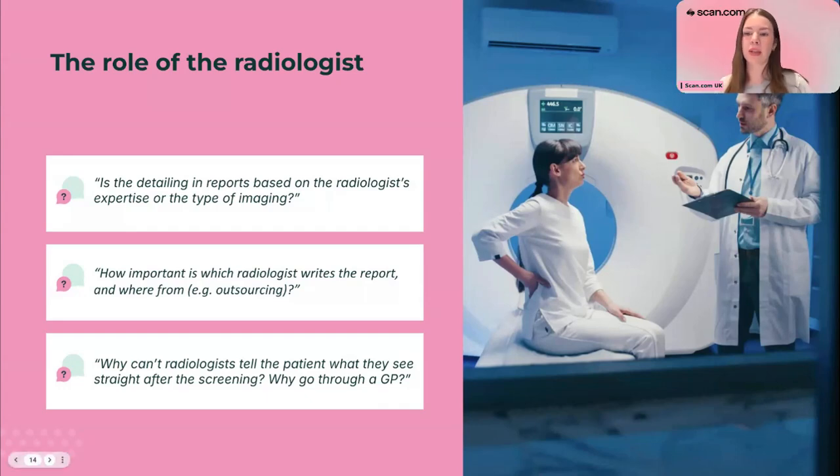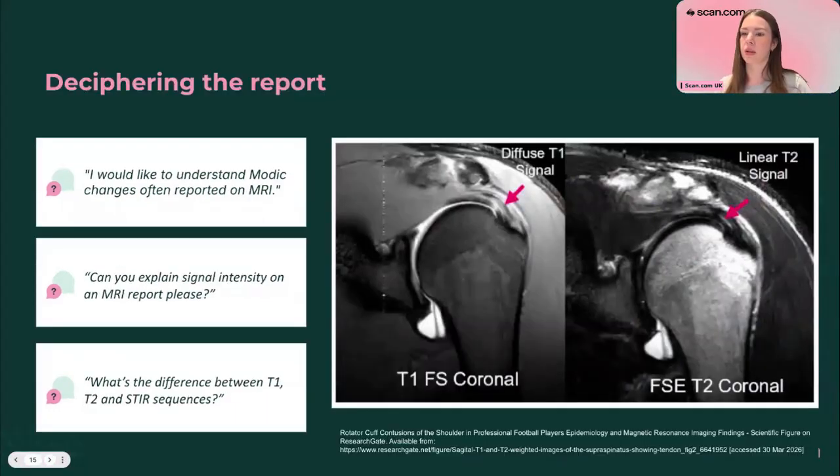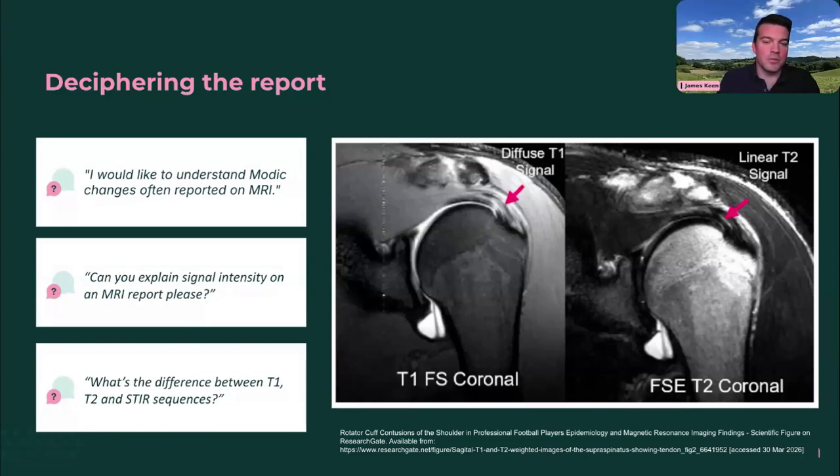Thank you. I'm keen to keep moving because we have some example cases, which I think were quite popular in terms of the questions. So perhaps we could do a quick rundown on signal intensity and the difference between T1, T2, and STIR, and then we'll move on to some questions about specific images. Without going into the physics of how any of these are acquired, because I don't want to waste everyone's time with that. We can do another call on MR physics another time if people are keen. But basically, you're going to see different things on these different weightings.